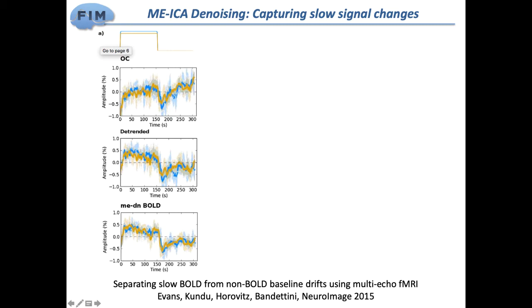I'm blanking on the duration. I think it's about a minute. Is a minute block design usually 3 minutes? Oh yeah, okay, 3 minutes. So it's a very long block design. This is usually going to be completely washed out if you do any type of detrending. And just to give some variation, she had a very slight amplitude change, I think, in the contrast of the images.